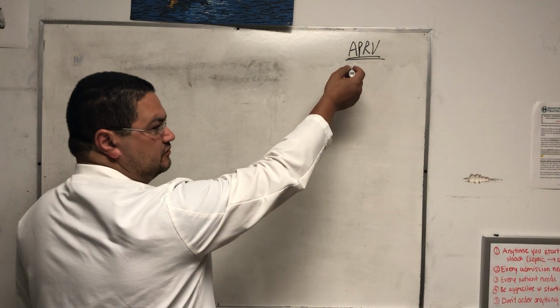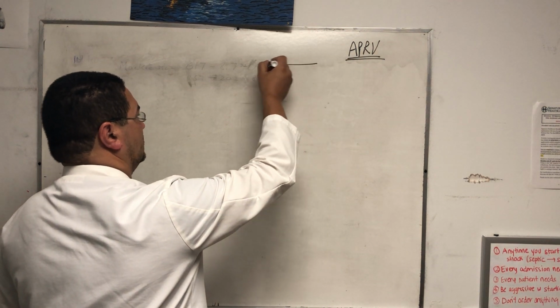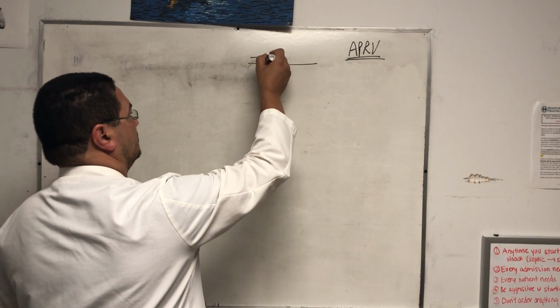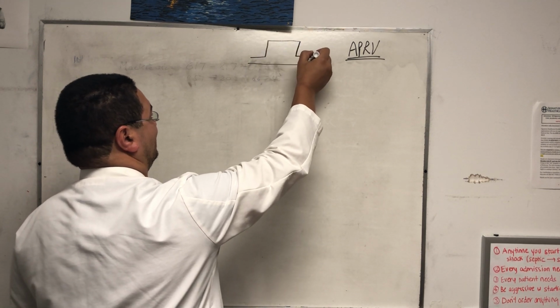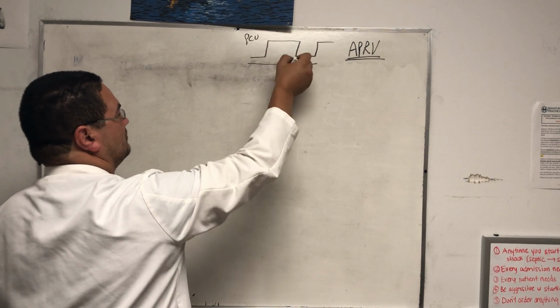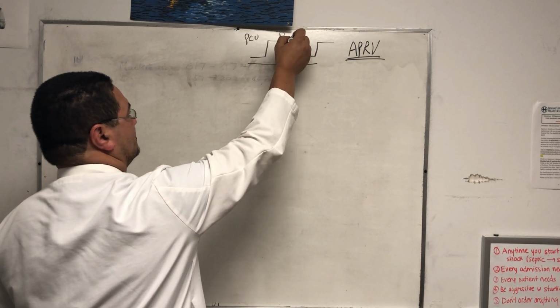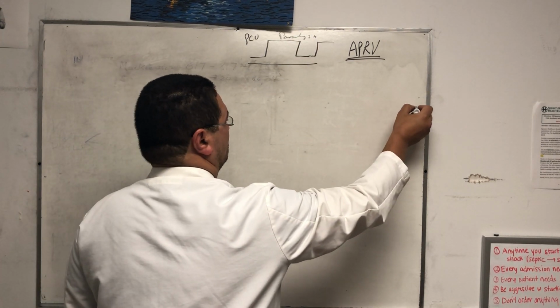This mode has been around for 25 years. I was playing with this when I was a fellow, so it's nothing new here. Tell that to the people that you know. So this is pressure controlled ventilation with inverse ratio. That requires paralysis. That's how it looks in the pressure waveform.